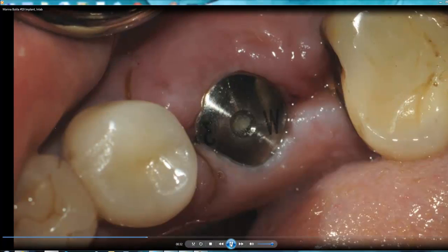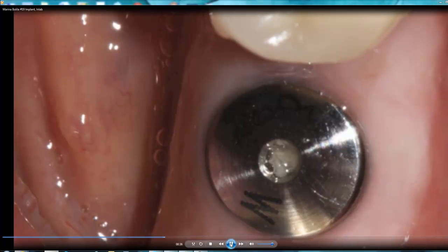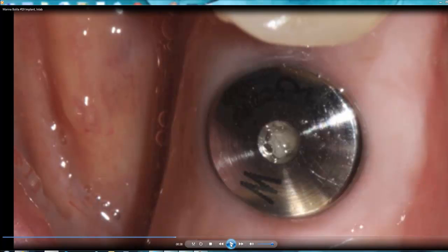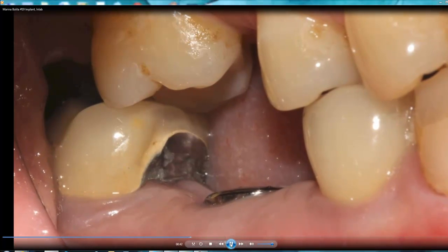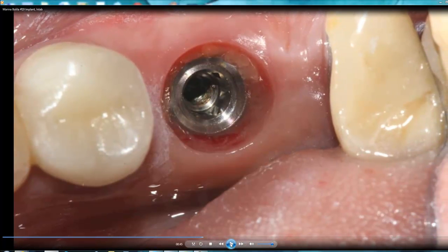The patient came back the next week and you can see how the tissue healed. Then the patient came back three months later for the final restoration. The tissue healed properly — nice, with no infection. We opened and removed the healing cap, and you can see the soft tissue around the implant healed nicely.